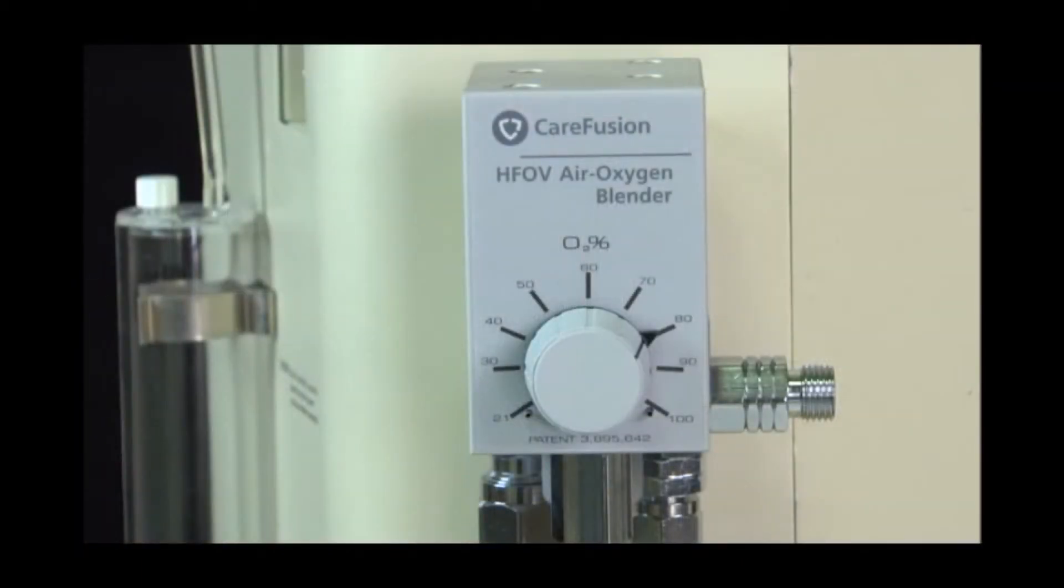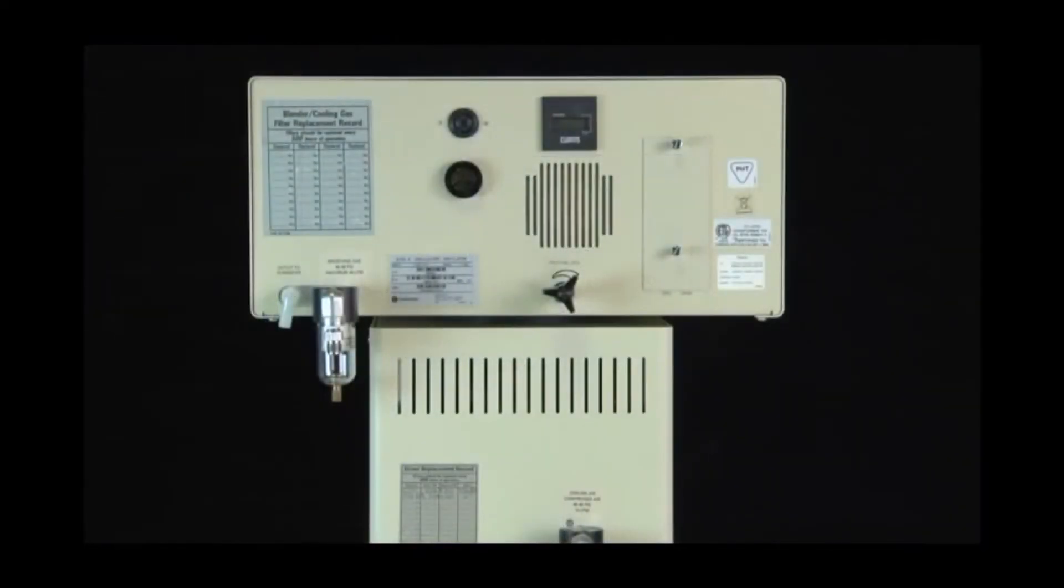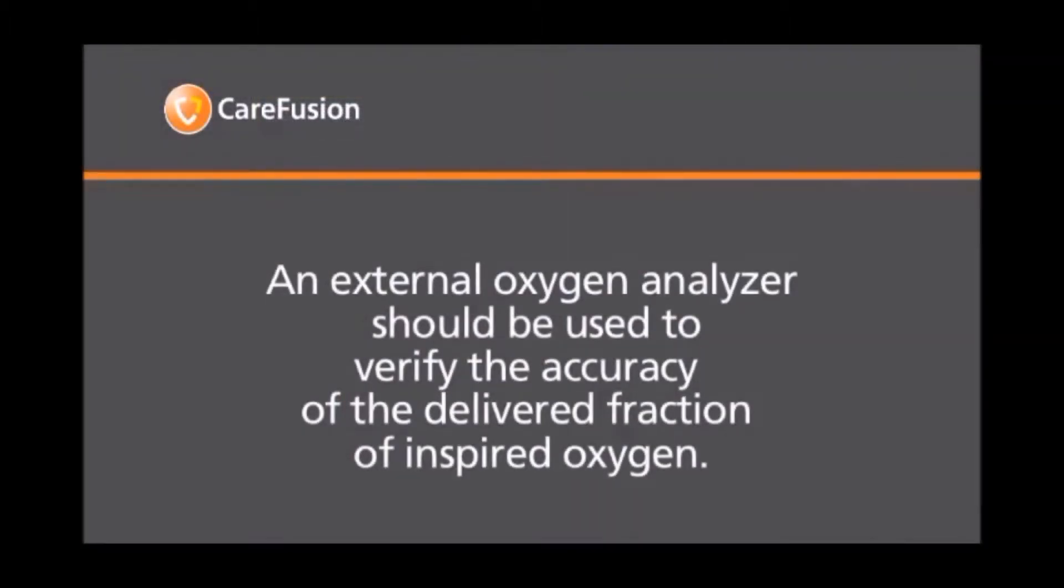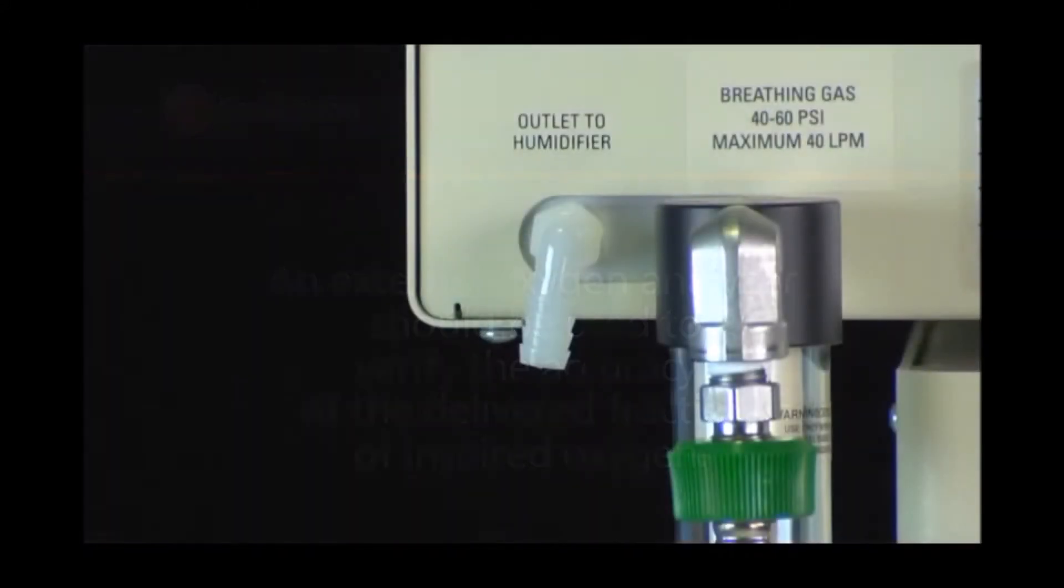An external blender must be used with the 3100B oscillator. The DISS connection for blended gases is labeled breathing gas. This fitting accepts a 50 psi input from the external blender. An external oxygen analyzer should be used to verify the accuracy of the delivered fraction of the inspired oxygen. The connector labeled outlet to humidifier provides patient breathing gas to the inlet of an external humidifier.